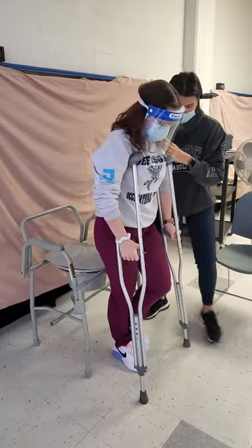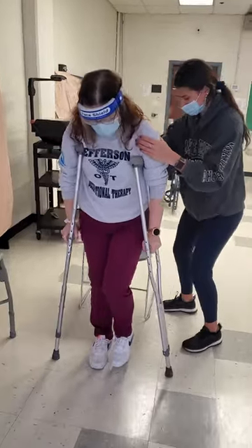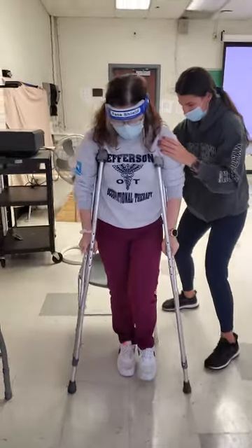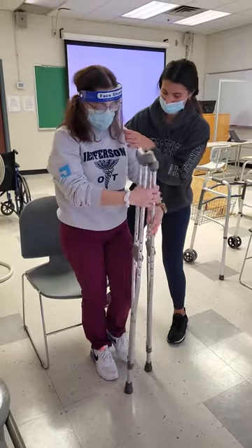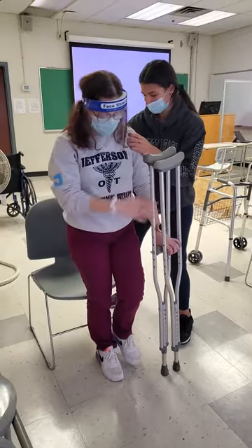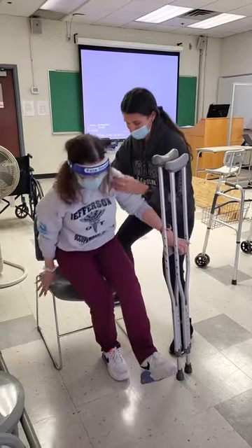We're going to crutch forward. And you're going to turn. And then crutch backwards until you feel the chair. And then set the crutches aside. And then on the count of three, we're going to reach back. And that's it — one, two, three. Okay.